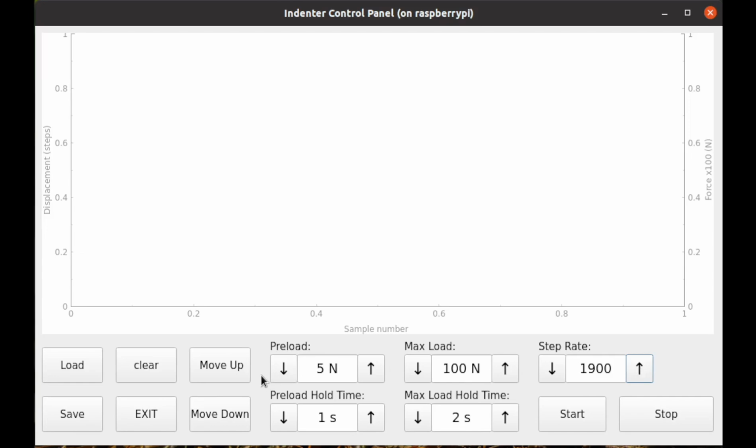Before we start a measurement, we first want to home the indenter. That's what our move up and down buttons are for. So let's start by moving the indenter head up into the fully up position. Now that that's done, we can begin our measurement. To do this, we hit our start button.